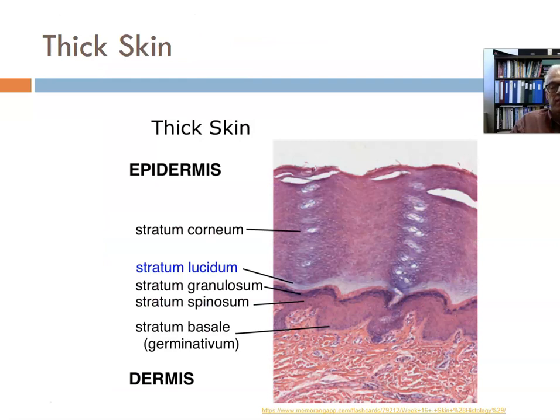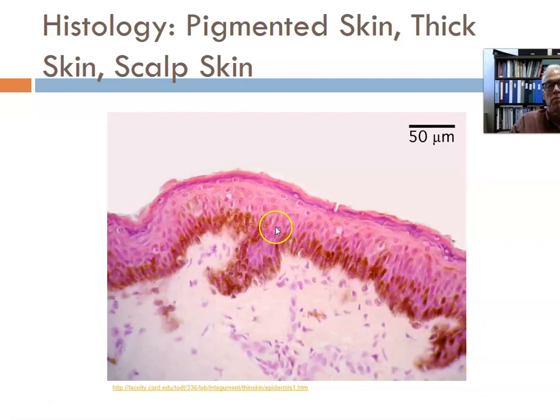Here is some thick skin. This skin is just probably some typical skin. This title says histology, and it lists some skin slides that we're going to look at. It doesn't mean that this slide encompasses all these things, okay?